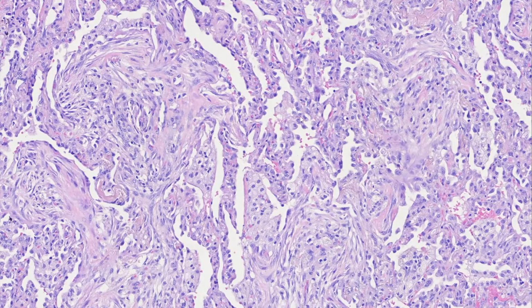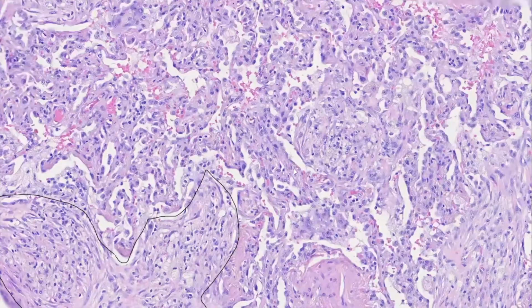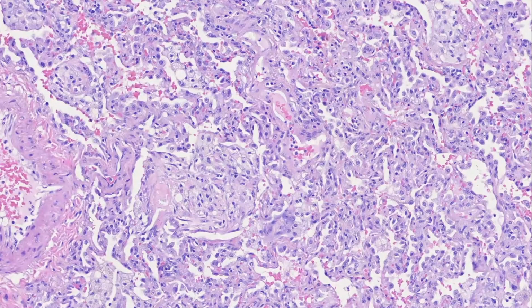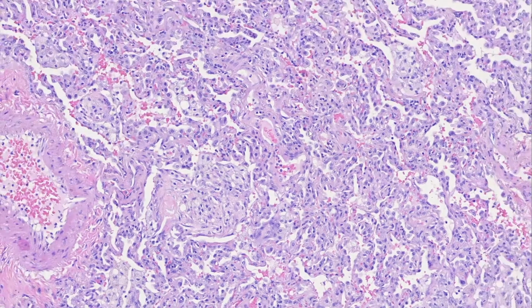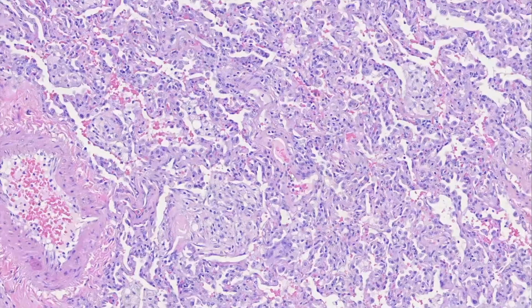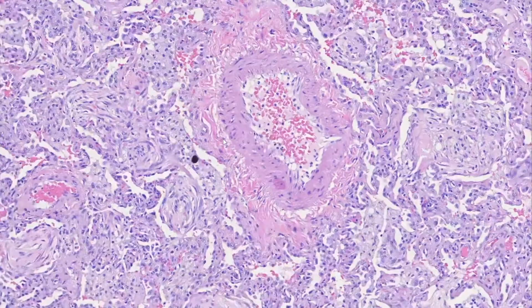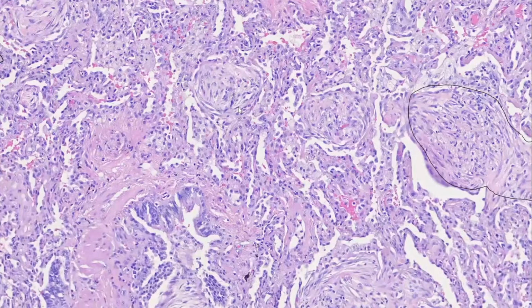There is a potential role for doing additional testing in some of these cases to look for potential fungal or acid-fast organisms that could be causing this, particularly if you see associated areas of granulomatous inflammation. An important point is also that this can occur secondary to obstruction and/or secondary to an adjacent lesion. So if you see a small biopsy that only has a little bit of organizing pneumonia, but radiologically they're describing a solid mass, this could indicate perilesional sampling.